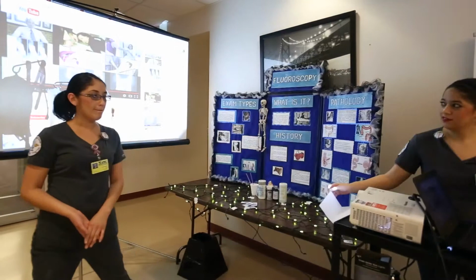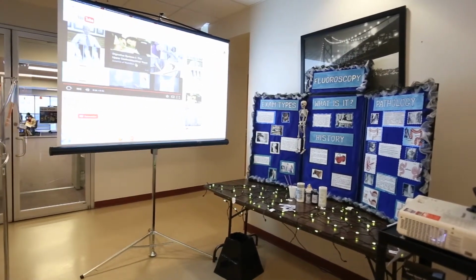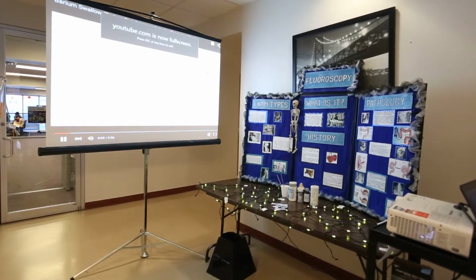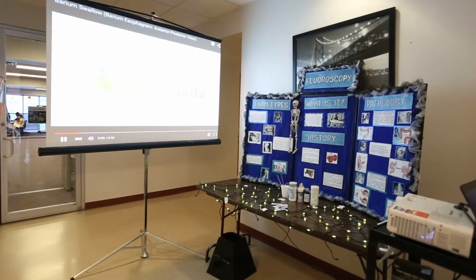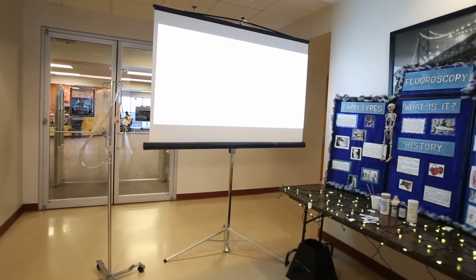We have some videos of the actual exam. And the first one is the esophagus study. Okay. And we'll actually be able to view the patient drinking the contrast as it's going down from the esophagus and into the stomach. And we'll actually be able to see the first pathology.